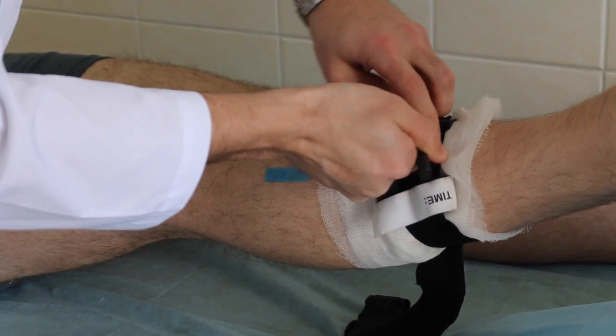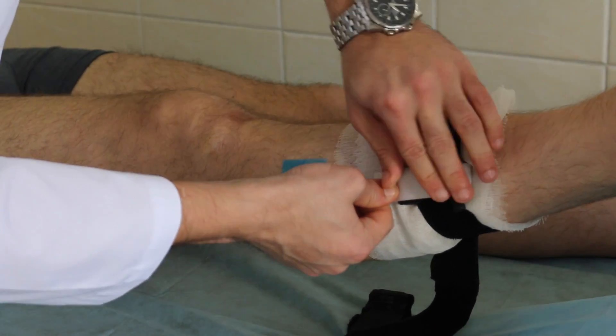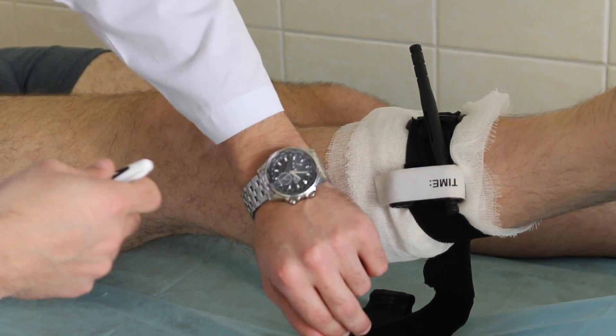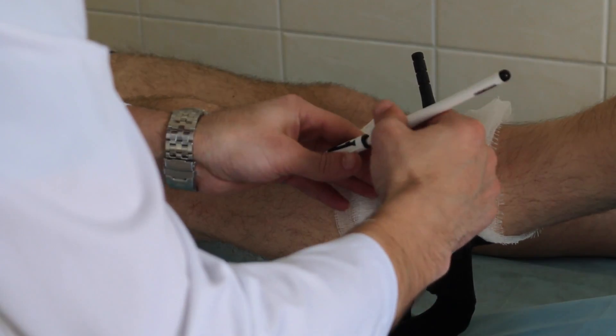Don't cover the tourniquet once applied. You should leave it in full view for medical personnel when they arrive. Using a tourniquet to stop bleeding prior to starting CPR efforts may help preserve the victim's own blood volume.